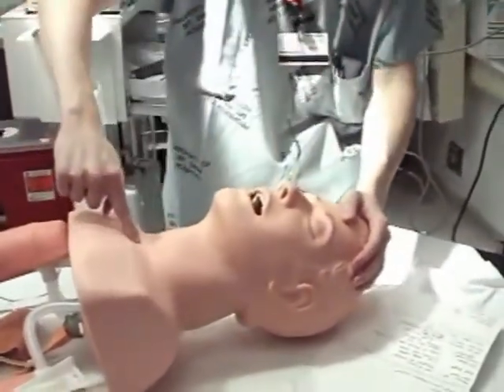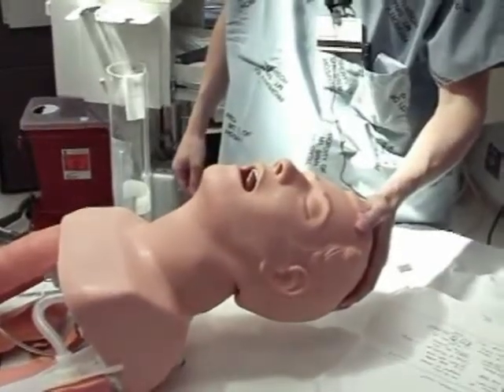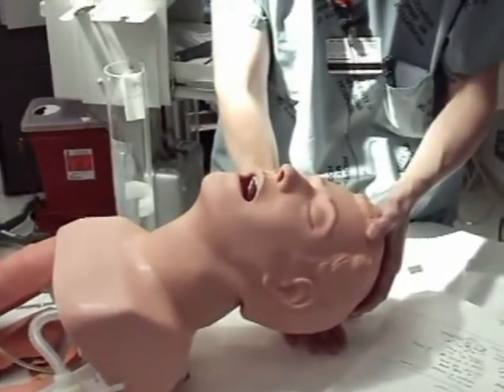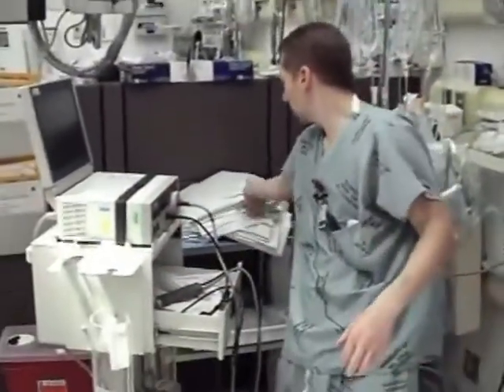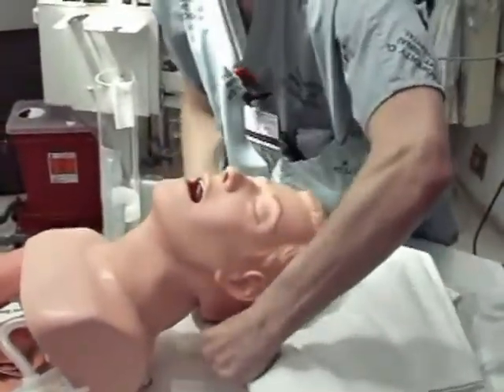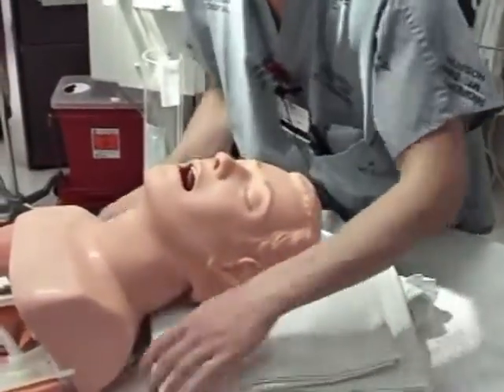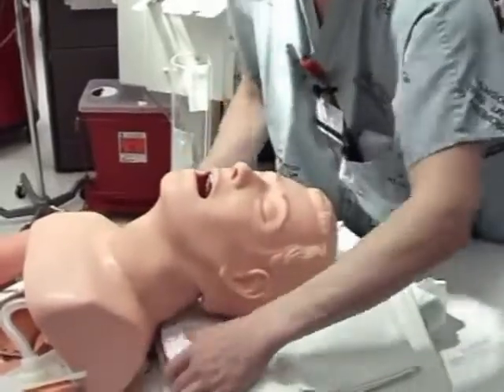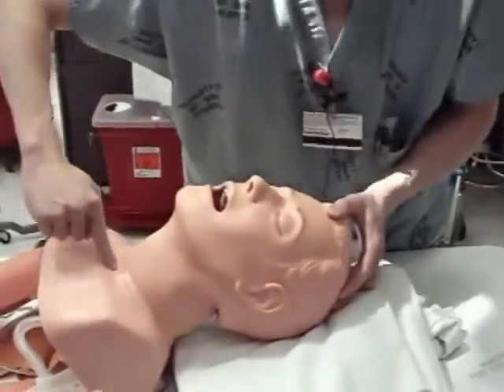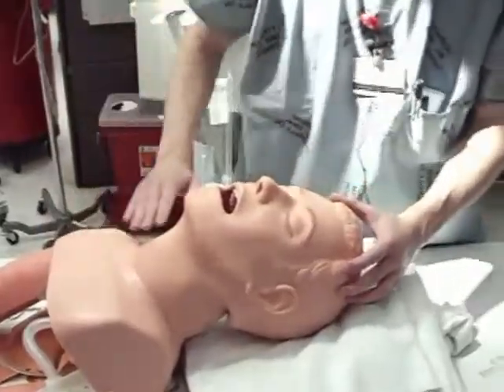Demonstrating on our mannequin: here's his ear hole, and here's his sternal notch. What we need to do is get them at the same level, which looks something like this — this is ideal sniffing position. You can see we have about five inches of space underneath his head. You could get a partner to hold up the patient, but a better way is to grab some sheets and stack those underneath the patient's head. For every patient, you should be able to draw a straight line from ear hole to sternal notch.